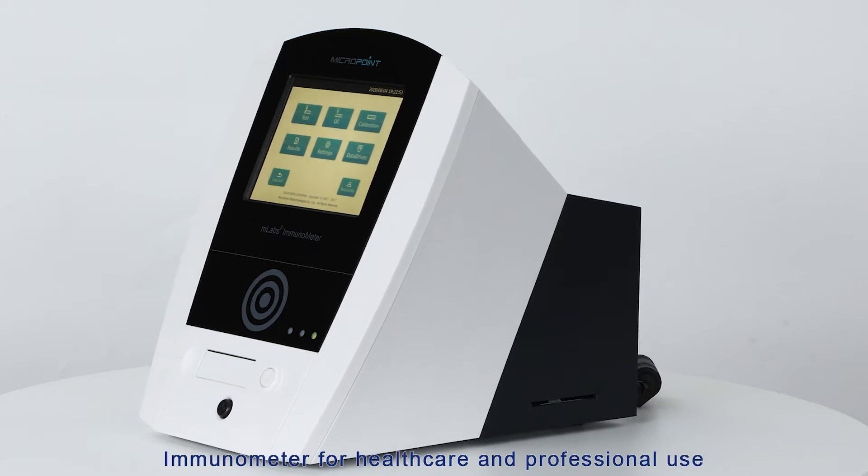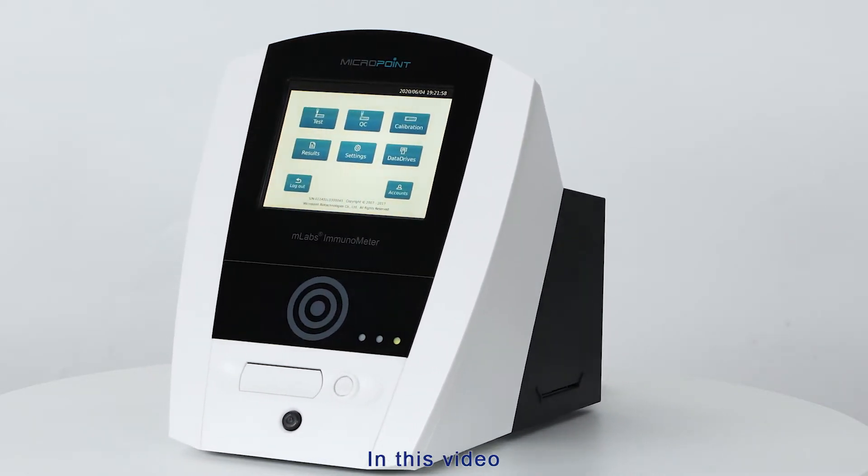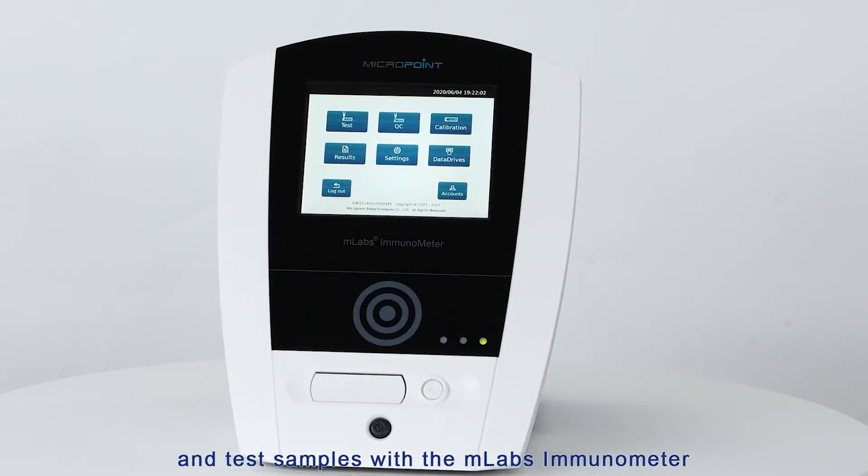Thank you for choosing the M-Labs Immunometer for healthcare and professional use. In this video, we will show you how to set up, calibrate, and test samples with the M-Labs Immunometer.